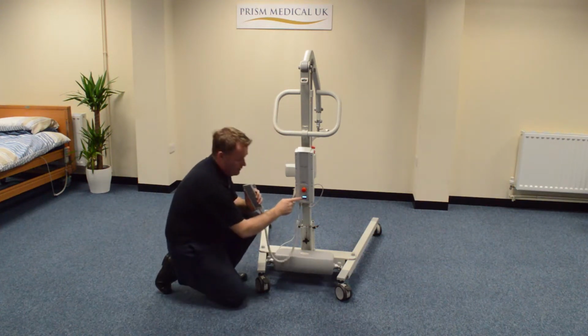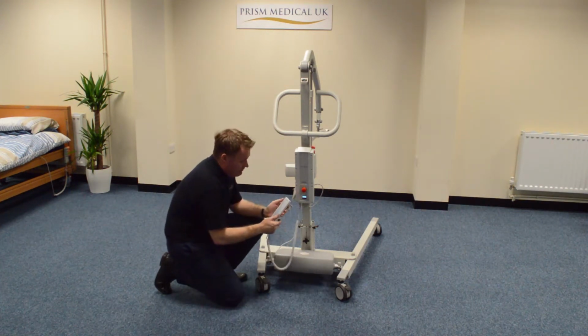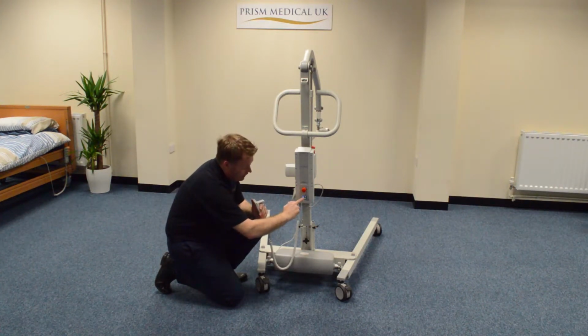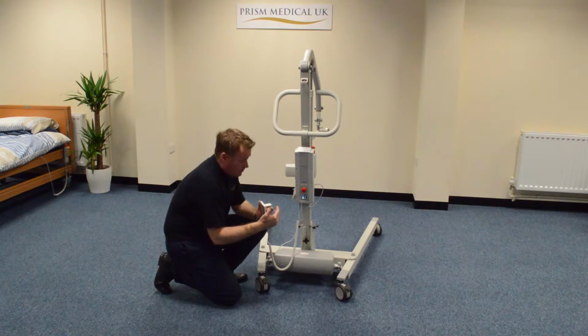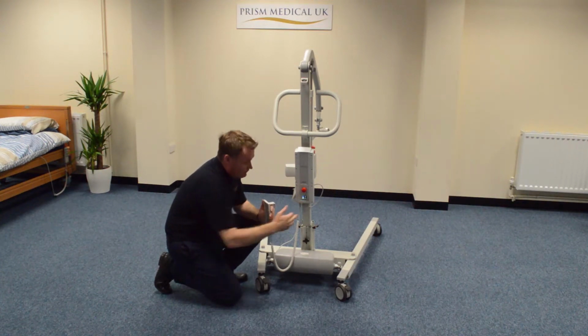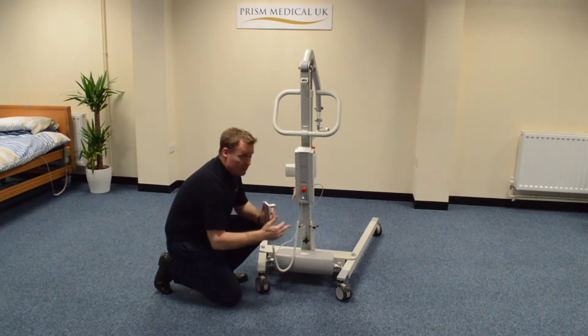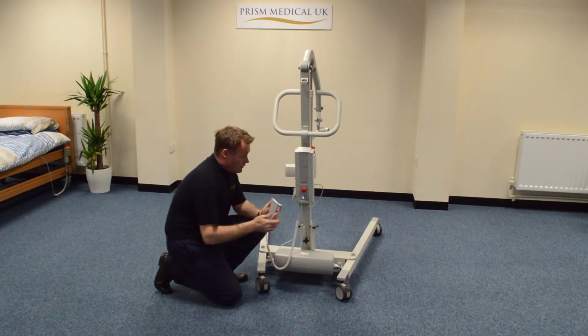The control box shows us the battery level indicator, but once we press the up button, it then gives us additional information, such as the number of lifts that the hoist has completed so far, the number of days until the next service is due, and it also tells us if the hoist has been overloaded at any point.